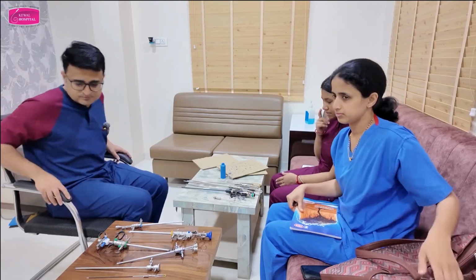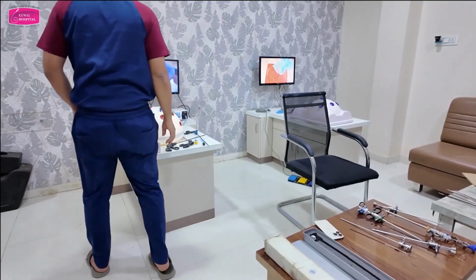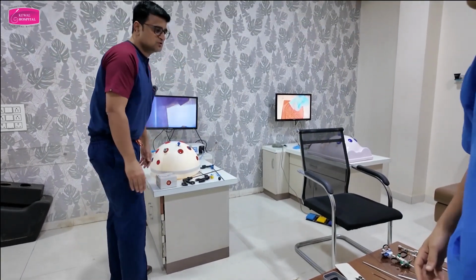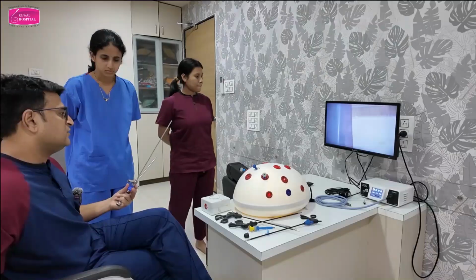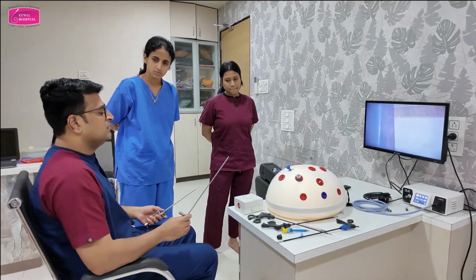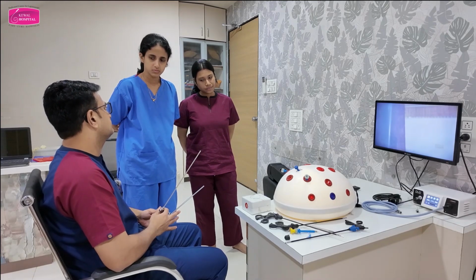Sure. Come here. Now here this is the uterus and we will do hysteroscopy in this, and I will teach you the basics. Now suppose there is one patient who has come to you for diagnostic hysteroscopy.